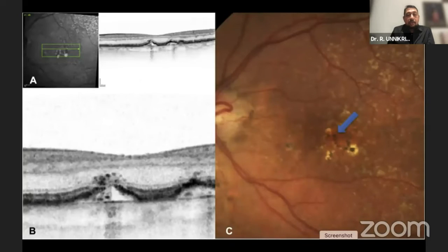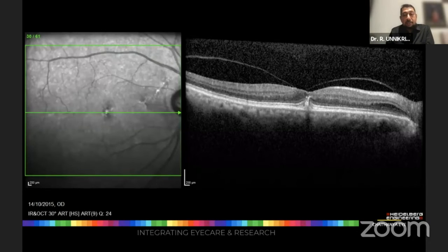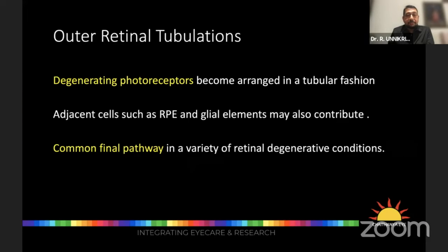Here are some of the pictures where you can see a clear deficit or an aperture in the RPE with material coming outside, drusen ooze, also a significant indicator of atrophic AMD. Here are some pictures in which you can see content coming out of the drusen. Wonderfully, here you can see a large gap in the drusen top with the material outside.